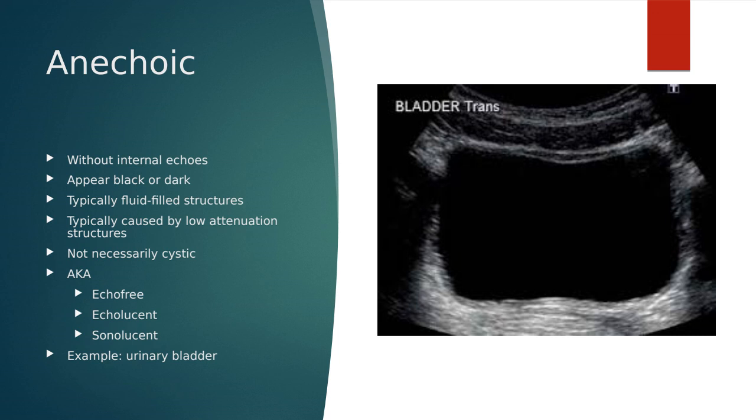These are typically going to be fluid-filled structures. So benign fluid-filled structures should be anechoic. This is because fluid-filled structures have low attenuation rates. Now you're probably thinking, I haven't heard the term attenuation up until this point. We talked about propagation. What does attenuation mean?